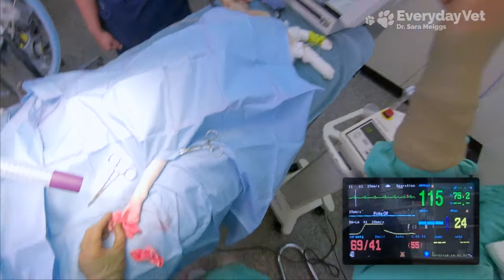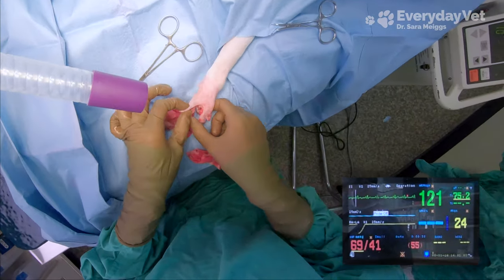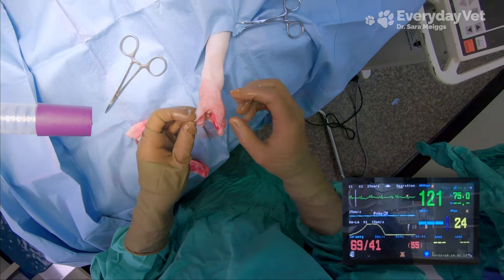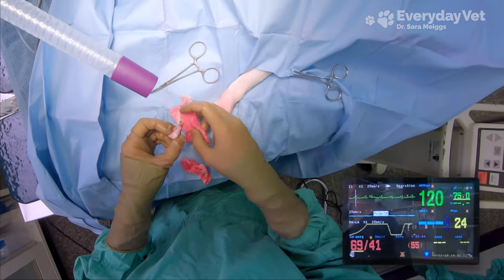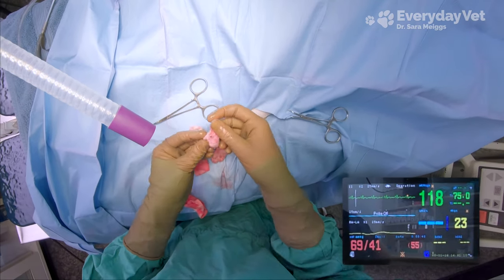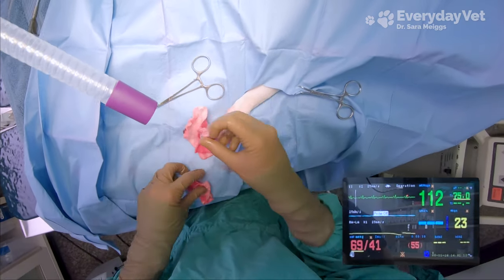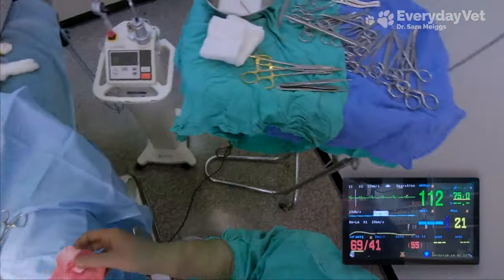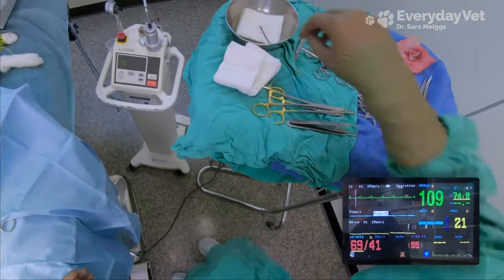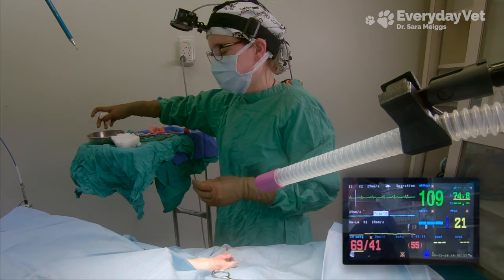That toe is amputated. I'm going to take a quick peek at the metacarpal bone where it was attached to make sure I didn't cause any damage there. It's looking good, so now we can go ahead and get it sutured. That's a nasty looking growth — that tumor had a weird bluish tint to it, so definitely not normal tissue. I'm very glad that we got that out of there.